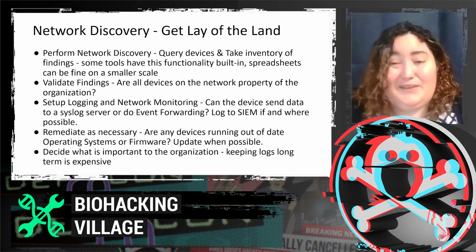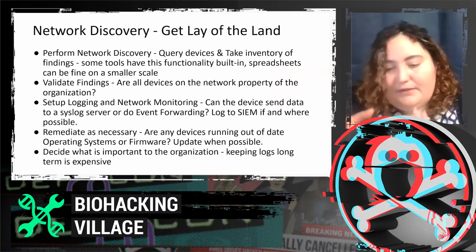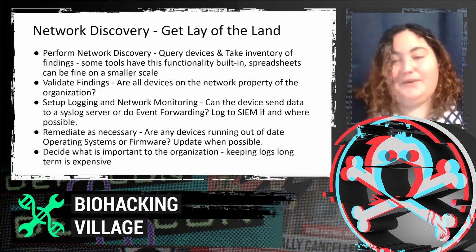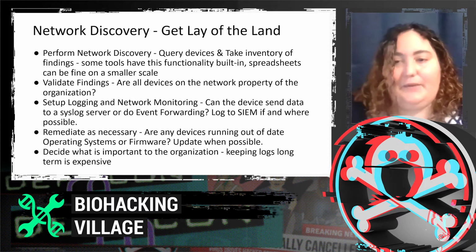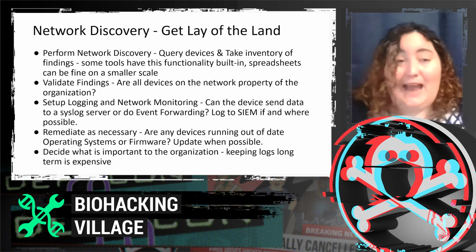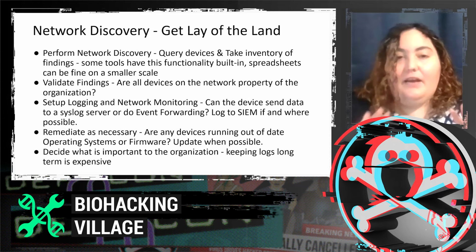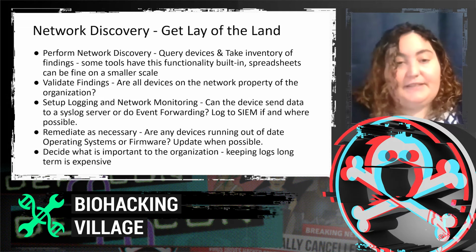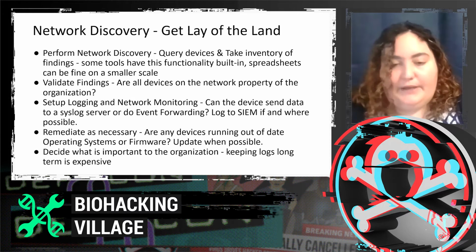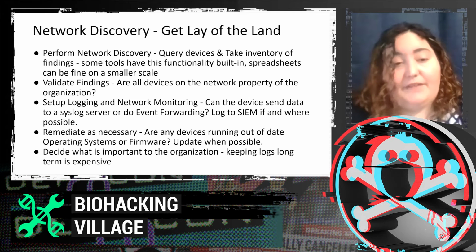Institutions are going to need to be aware that certain brands of devices or certain device models do not like being scanned, and so you're going to want to avoid doing this kind of heavy network discovery while they're in use. Or you're going to want to have that dialogue with your medical device manufacturer to see if you have some of those devices, and then perhaps take the device offline, or create a strategy for managing that device while you're discovering everything else on your network.